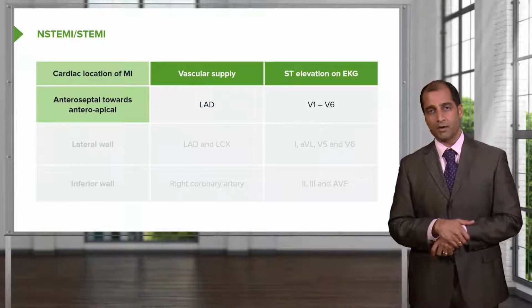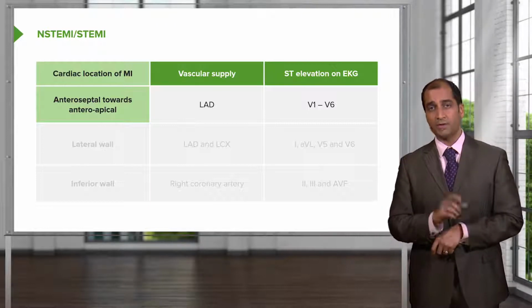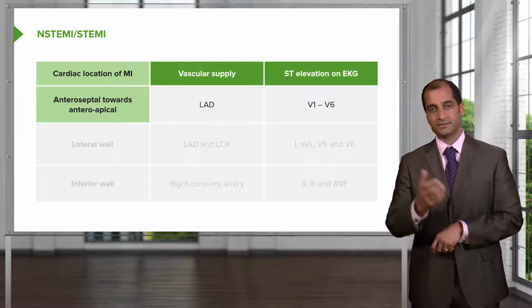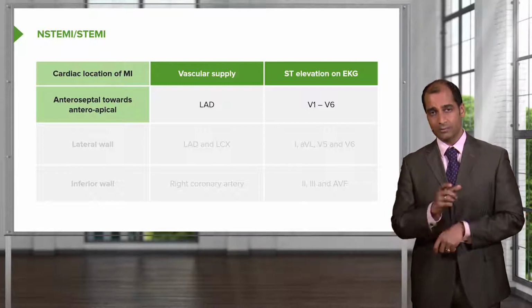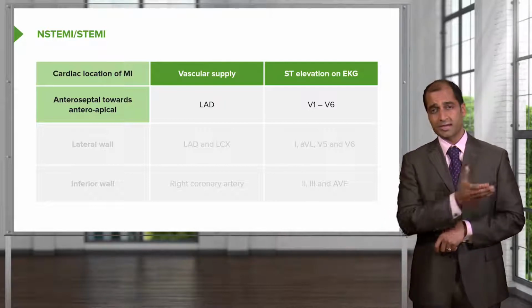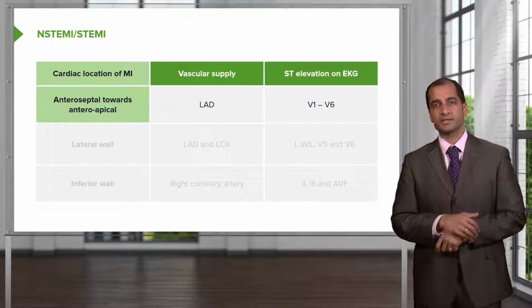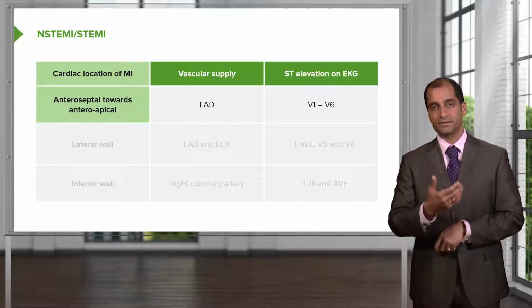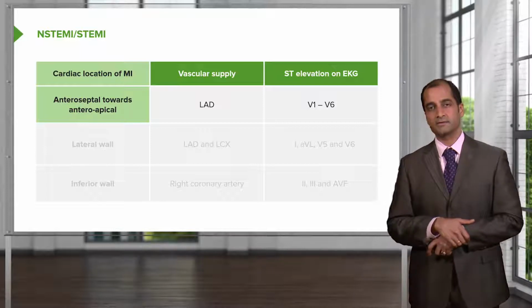Now, here we go. Told you earlier that we were going to walk through the different coronary arteries and their respective ST elevations, arteries. I very much wish to bring to your attention that I did not say arteriole. So let's take a look at left anterior descending, which is the artery, and where exactly on the heart is it supplying? Take a look. Anteroseptal towards the apex. Okay, so I want you to go in that order of your precordial leads. Begin at V1, because that's your interventricular septum. Anterior 2/3 of your interventricular septum is your LAD. Used to be called, and still is, the Widowmaker, right?